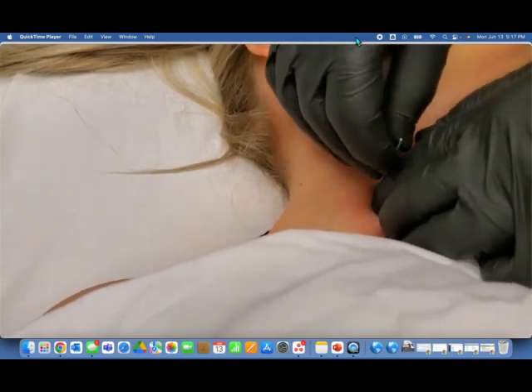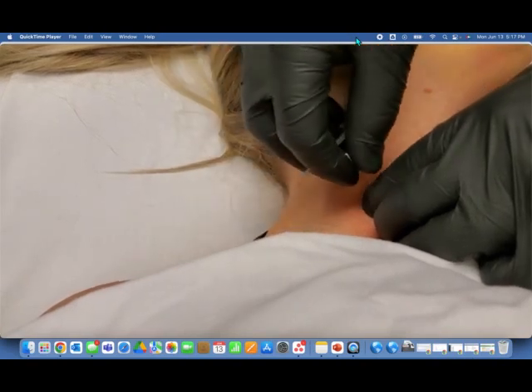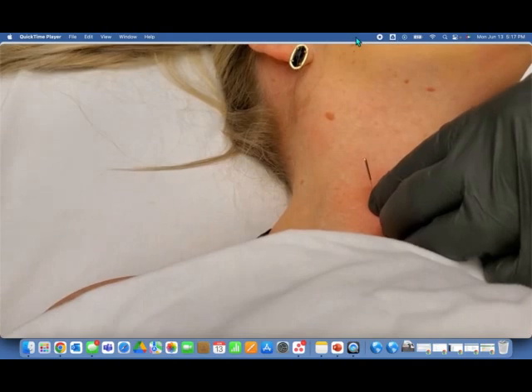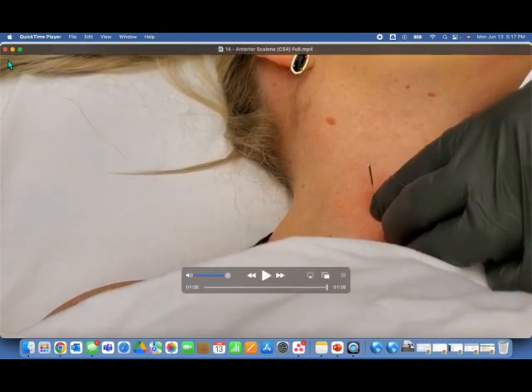So pull immediately, exposing our location, and advance just 2 centimeters, less than 3.